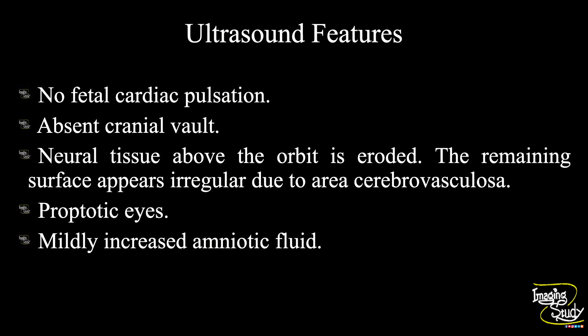In summary: we couldn't see any fetal cardiac pulsation; there was absence of cranial vault; neural tissue above the orbit was eroded; the remaining surface appeared irregular due to area cerebrovasculosa; the eyes were proptotic; and amniotic fluid was mildly increased. So this is a case of dead fetus due to anencephaly.